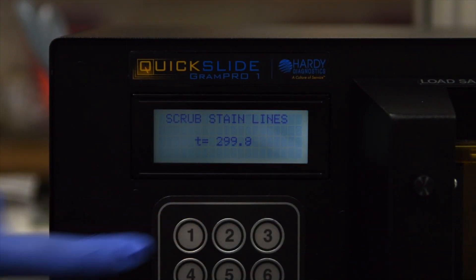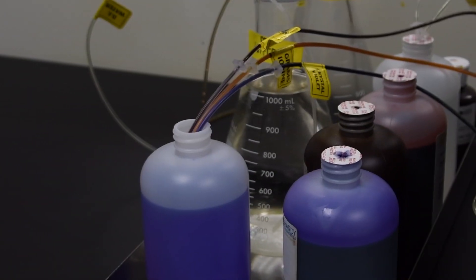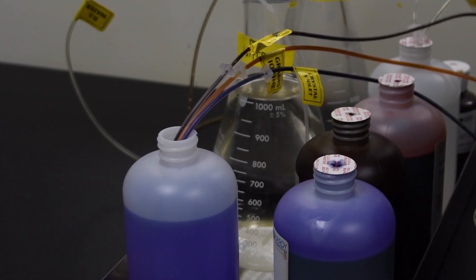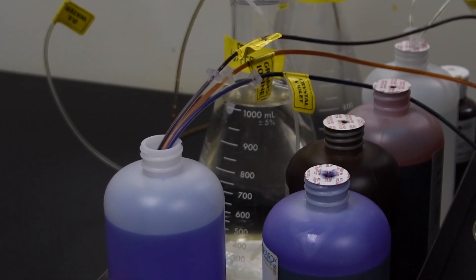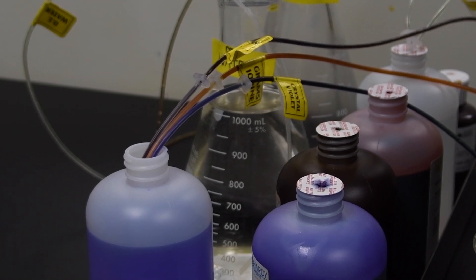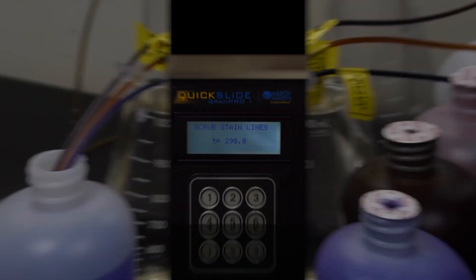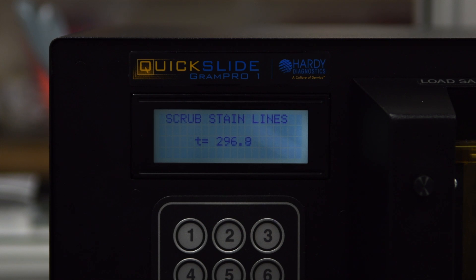Press 1 to return to the scrub. The reagent lines will now have decolorizer or bleach, depending on the purpose of the cycle, washed through the lines and the cuvette. This normally takes about 5 minutes.